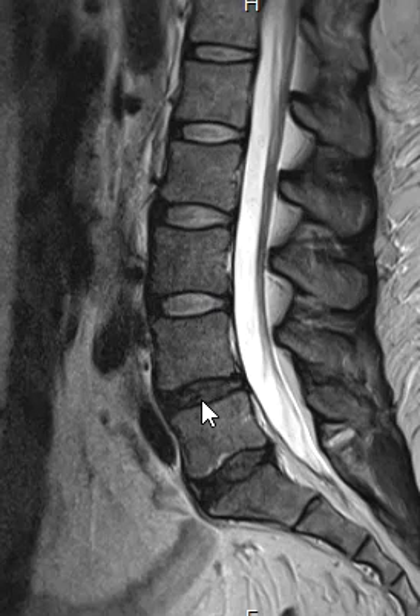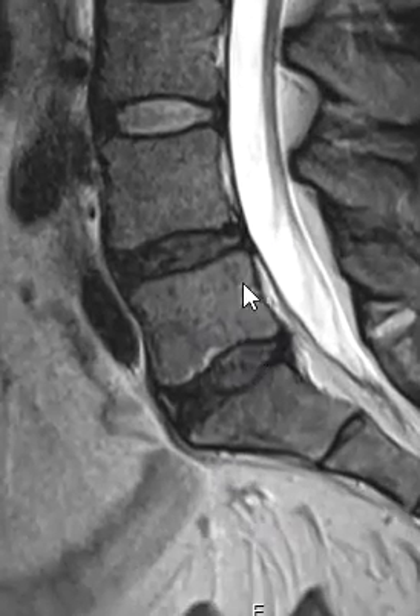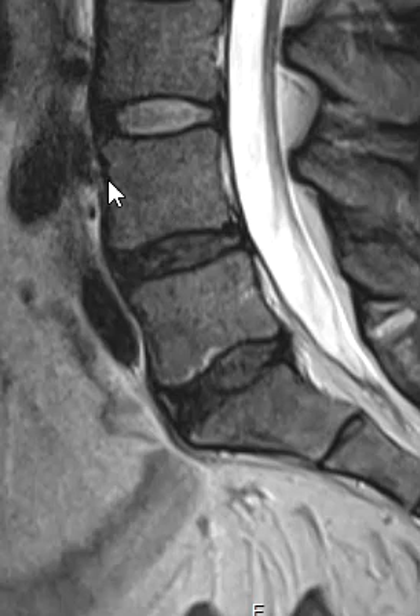That means the discs are healthy when they have fluid in them. When they lose their fluid or become desiccated, they become dark like this. And so we can see right at first glance we have some trouble with these lower discs. If we zoom in a little bit here, we can see that this vertebral body has slipped forward slightly at L4 on L5.